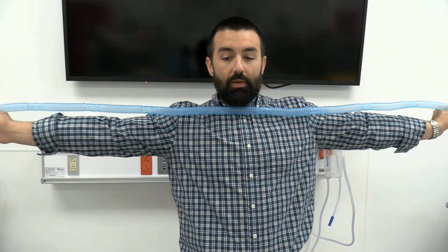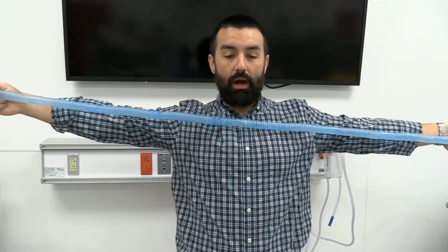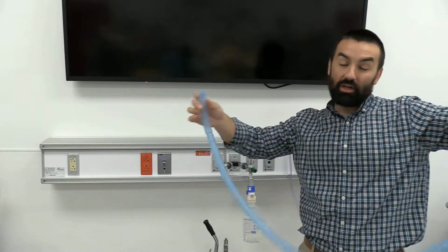If I'm trying to cut this off myself, okay, what I generally find, I'll try and trim this stuff up back in the apartment. If I get about enough, so we're gonna need 2 pieces, and I'll kind of show you why in a second. 2 pieces that are about my arm's width apart, okay? If you're shorter than me, most people aren't, you can make it a little bit longer. Likewise, if you're taller, maybe a touch shorter there, okay?